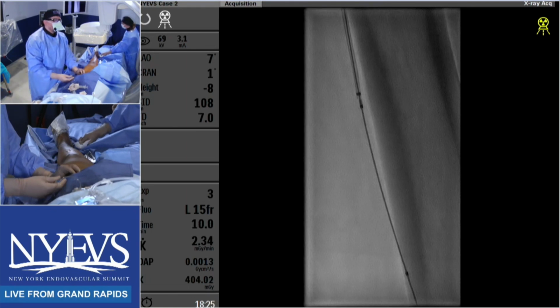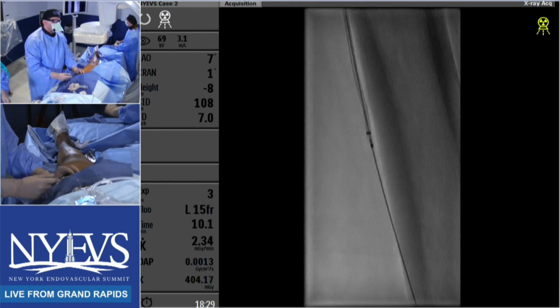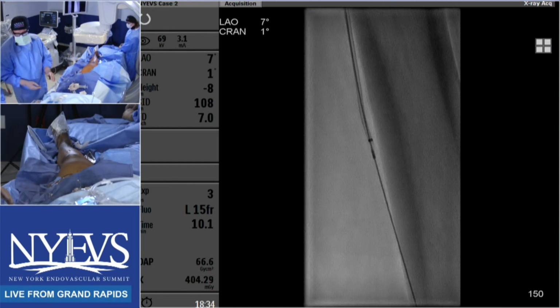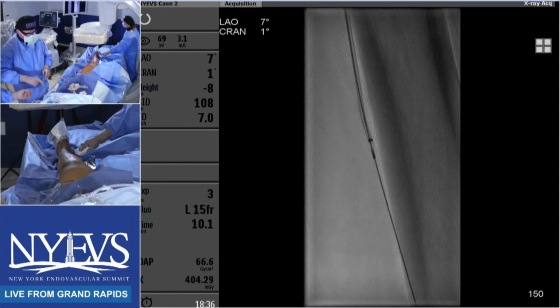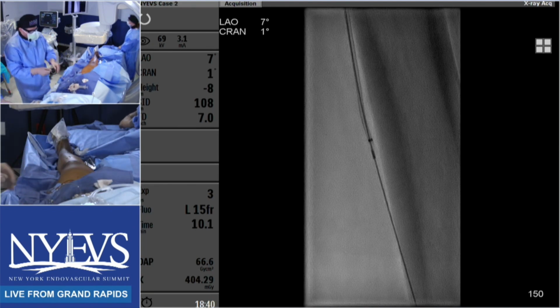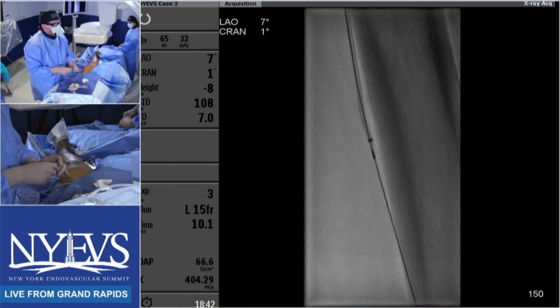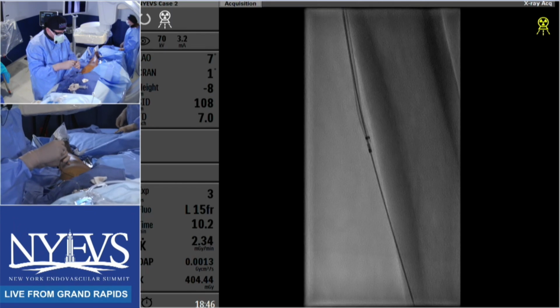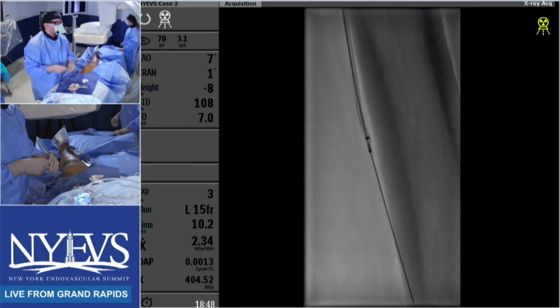I will say, though, this is the primary thing that we do. We show these cases. It looks incredible. It is incredible. As soon as he gets that wire into the crossing catheter, we're all clapping. But remember, the data says it takes 200 days for a diabetic foot wound to heal once you have flow. So I think the argument is never necessarily whether you can do it, but what's the plan for the end point, which is the healing.